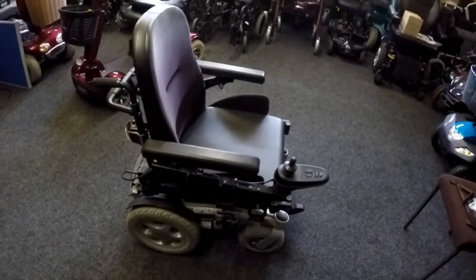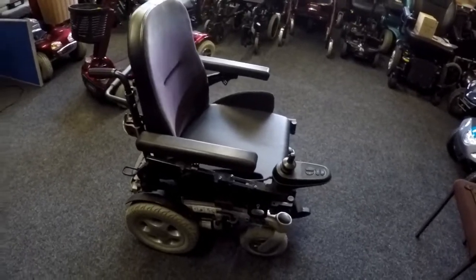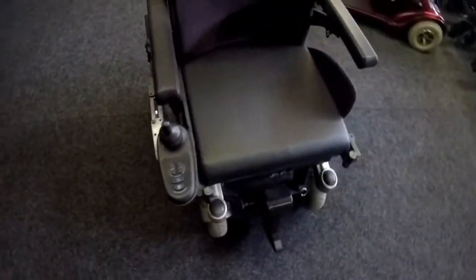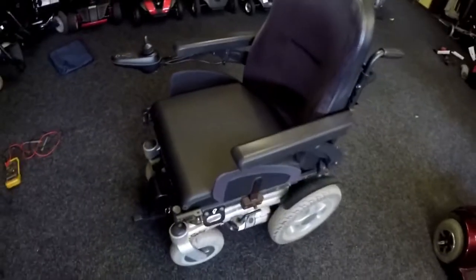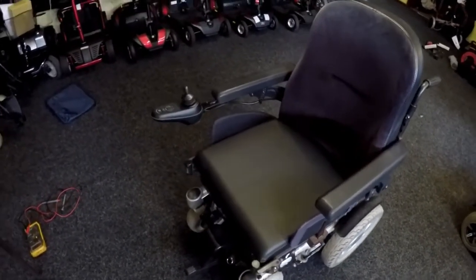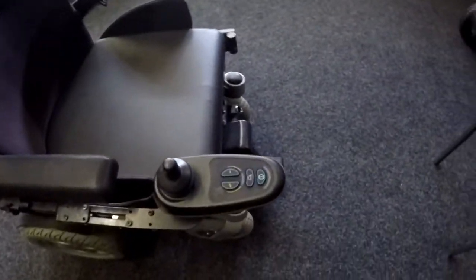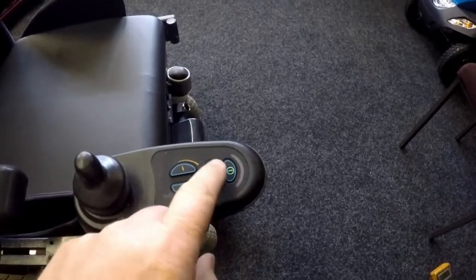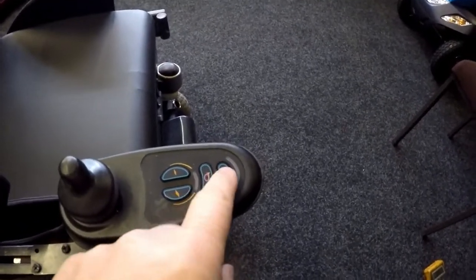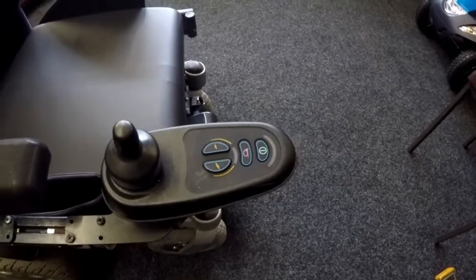Today we've been given a Salsa power chair, Sunrise Medical Quickie. The chair's quite a few years old, well used, but usually in working order. The customer stated that it's having problems with the on-off button on the joystick. Whenever he presses the button, the button sticks in. Same with the horn, and this has been happening for quite some time.